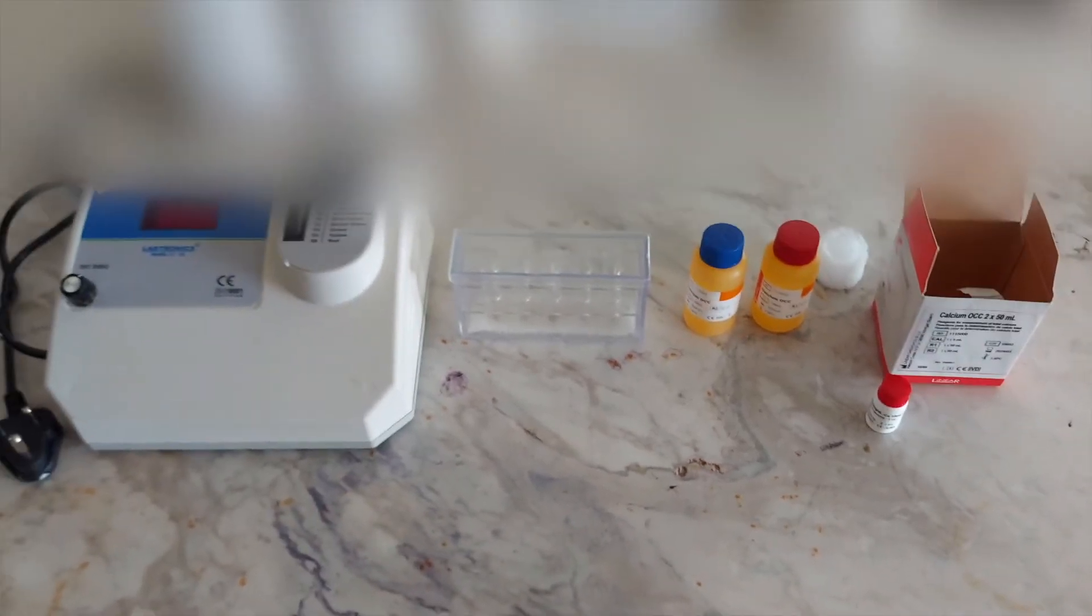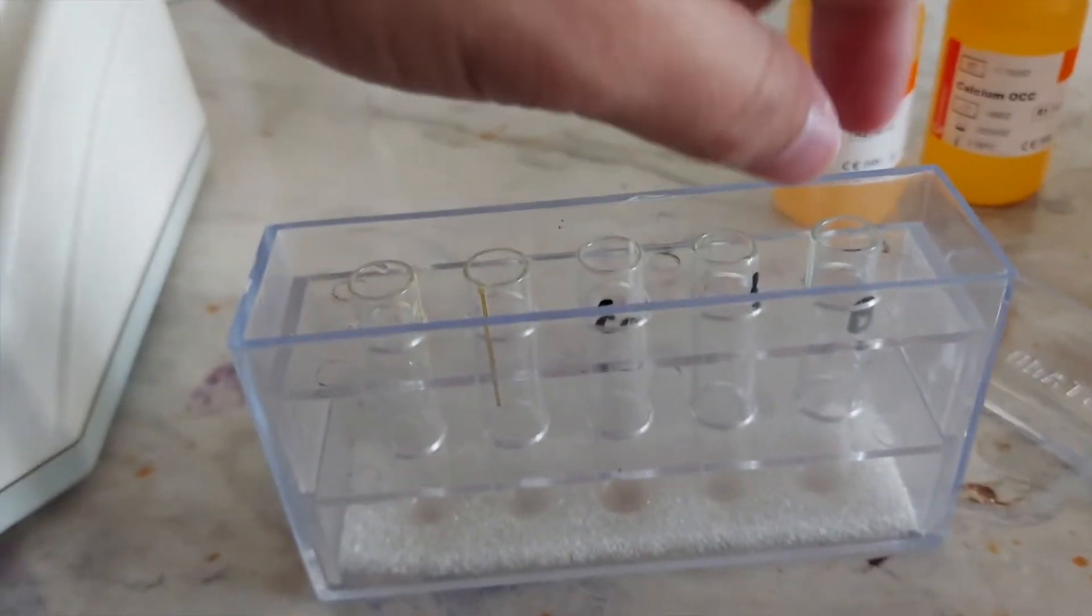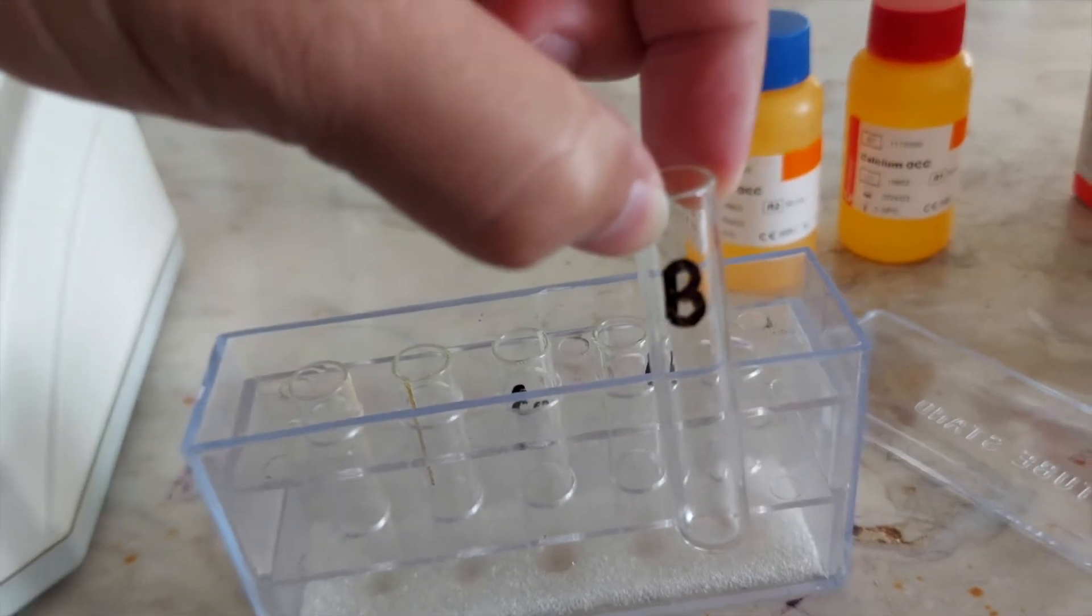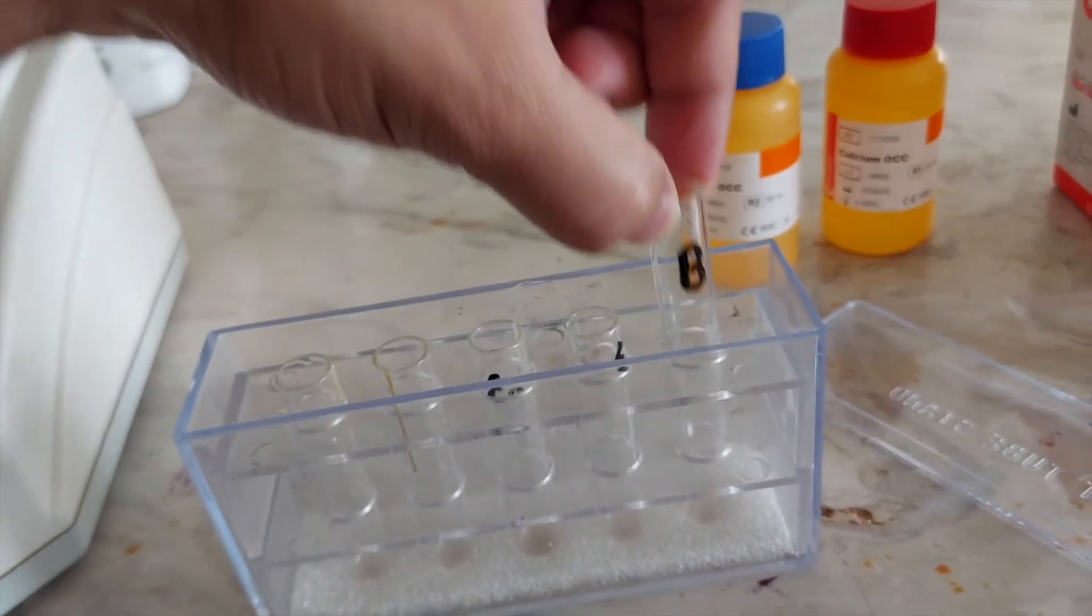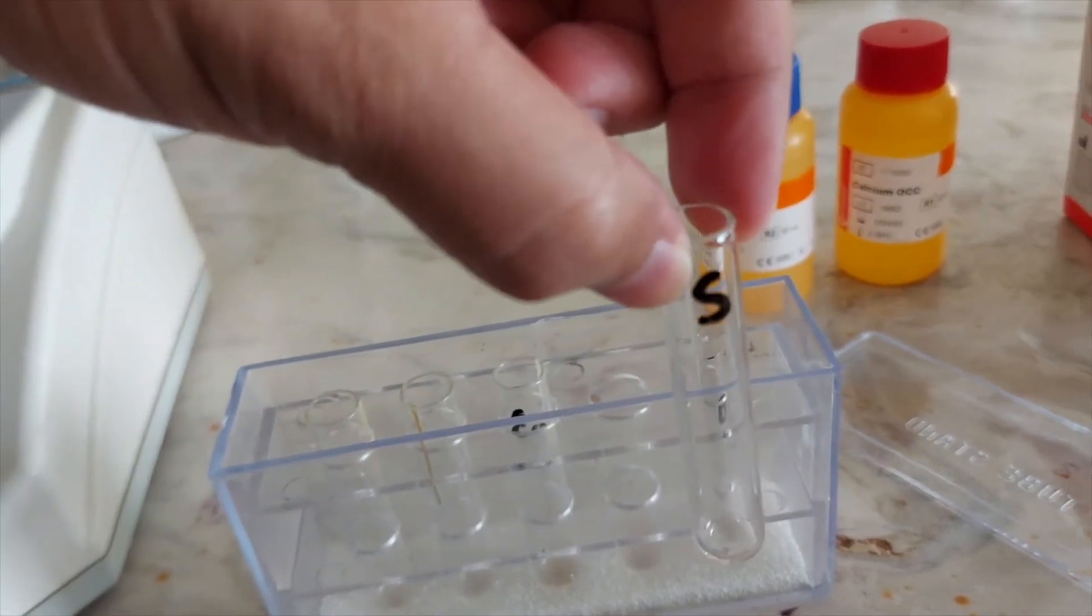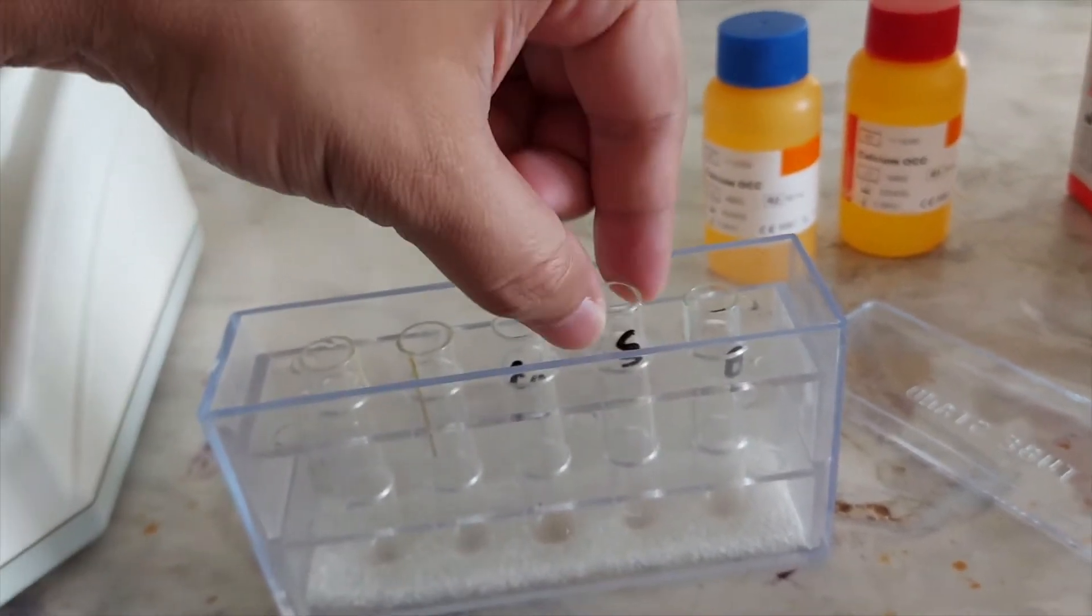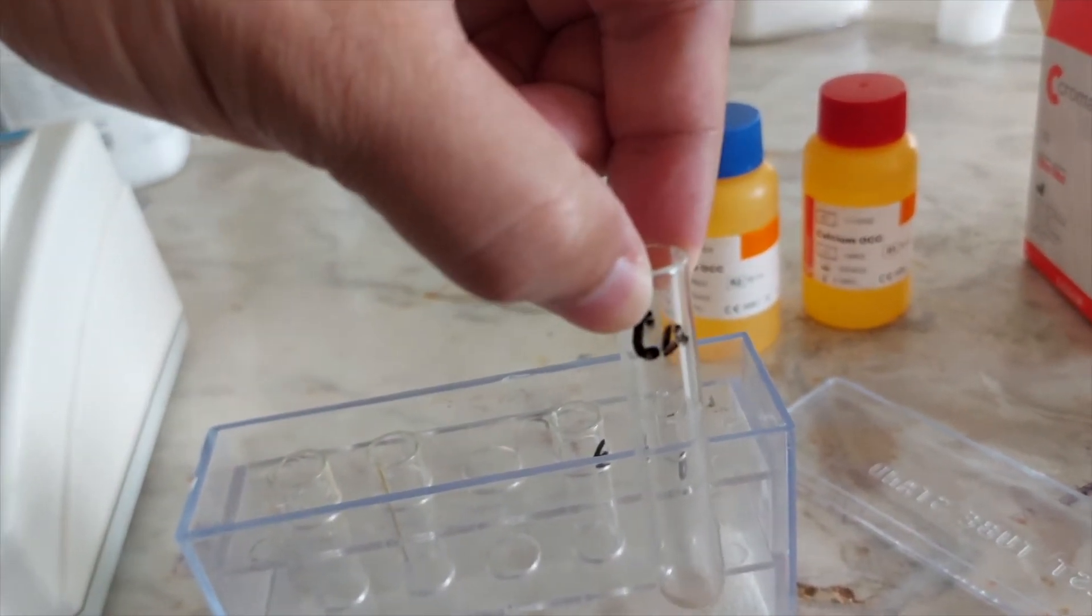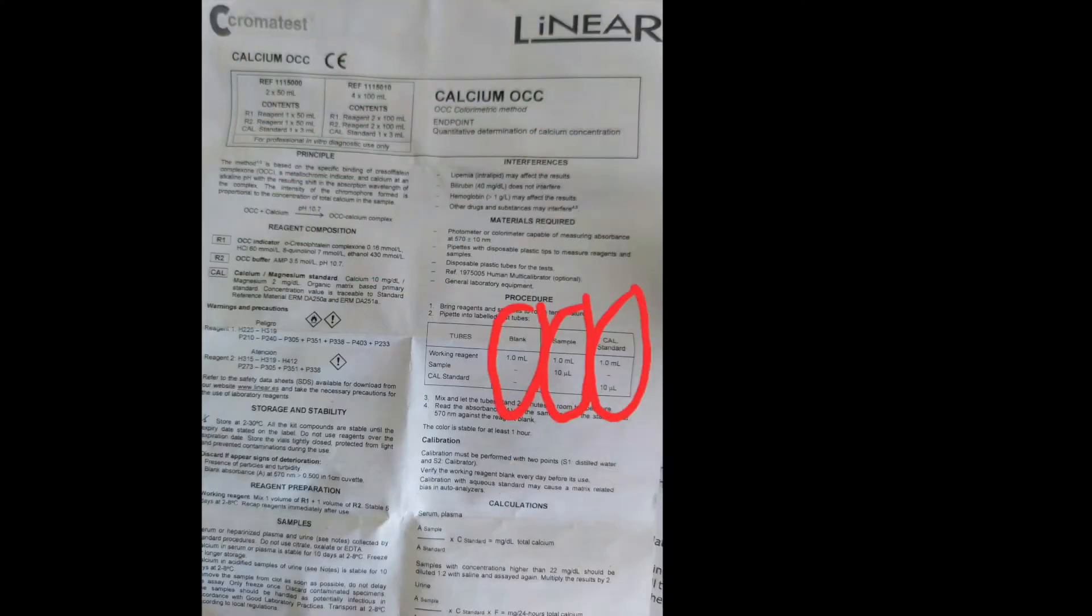Now first of all, we are going to make the working reagent. I have already labeled my cuvettes. This one is B or blank, which will contain only the working reagent. This one's S, and it will contain working reagent and the sample. This is labeled as CA, hence will contain working reagent and the calcium standard.